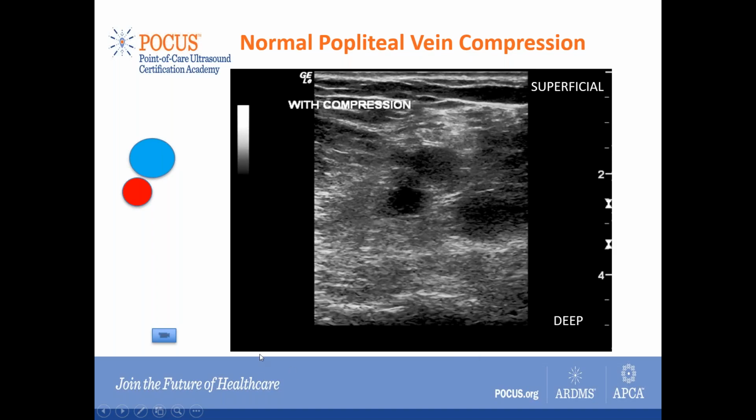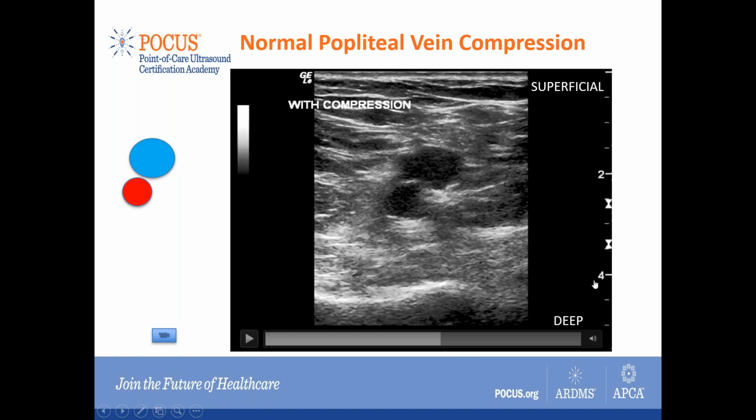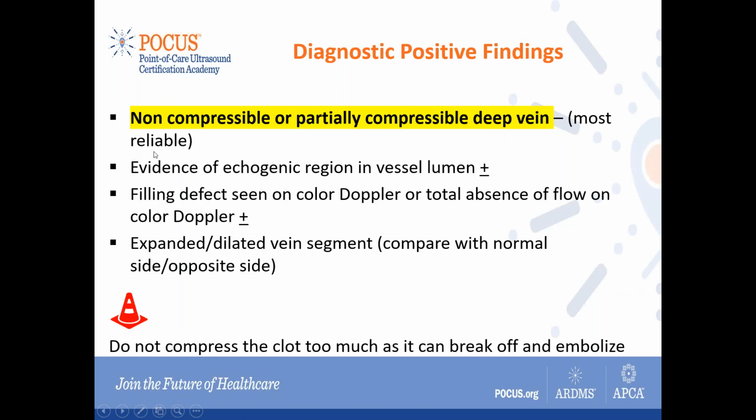So the test, as you can see, is very, very simple. There's nothing complicated about it. So how would you diagnose it? Either you see the clot, if it's present, but that's not very reliable at times because it could be artifact too. The most reliable thing is the compressibility. So non-compression or a partially compressible deep vein. Make sure you're putting adequate pressure. Other things like color flow could be done, but they're not very reliable or that sensitive, but they could be adjunctive.